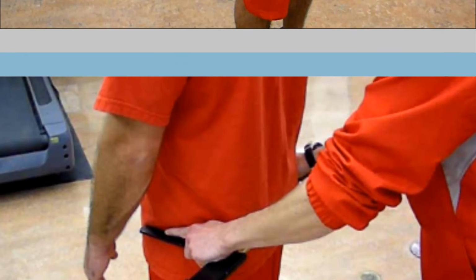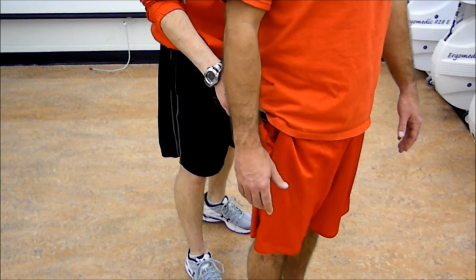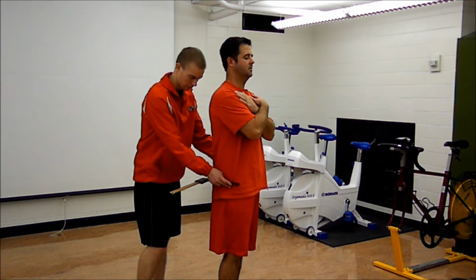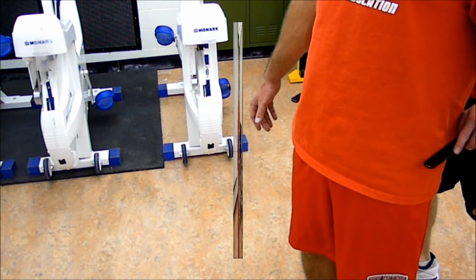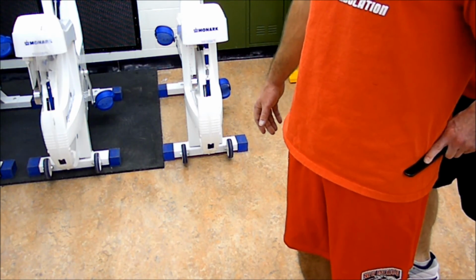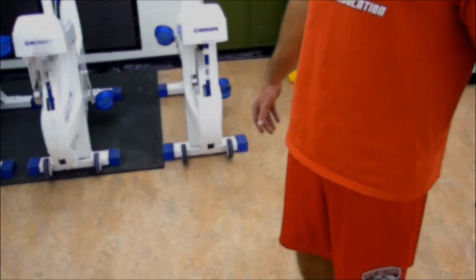It may help to have the participant flex their leg at the hip to find the greater trochanter initially. The caliper blade should be held horizontally while the participant is standing upright with the technician standing behind them. This measurement may require considerable pressure due to a greater subcutaneous adiposity or muscle mass. The maximal distance between the trochanters should be recorded while firm pressure is applied.